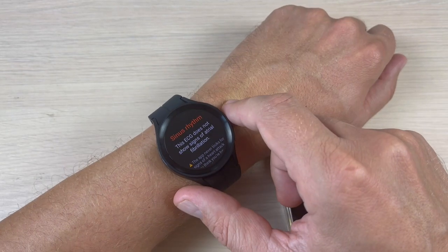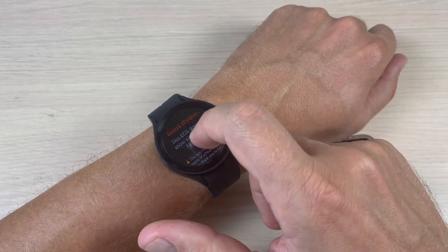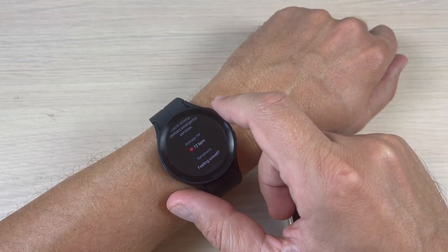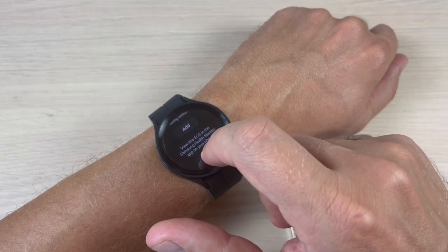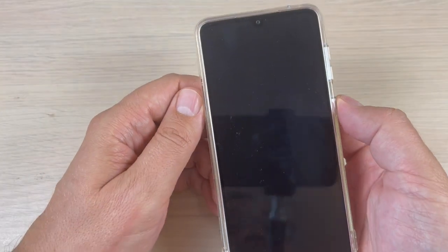And here is the result: sinus rhythm. The ECG does not show signs of atrial fibrillation. The heart rate is 72 bpm. Now I will press 'Done' and let's go to the phone.